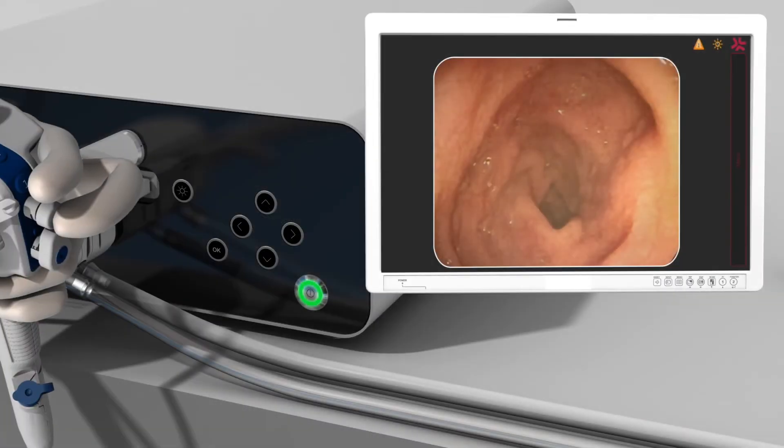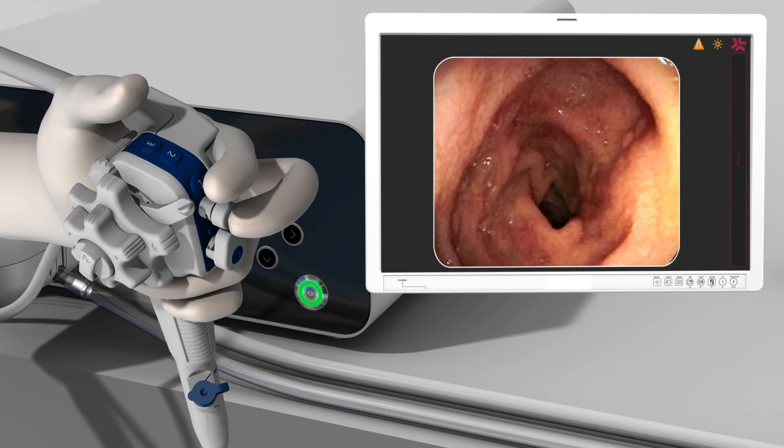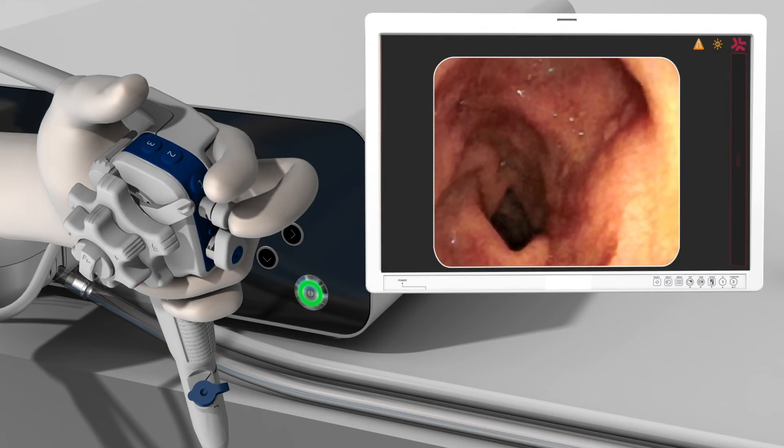The A-Scope Duodino is equipped with three remote switches which can be programmed for various functions through the interface. The A-Box Duodino will capture one image for each press of the switch. It is possible to first freeze the image to ensure it is the correct image for archiving by first pressing switch 1. The live image will continue via a picture-in-picture window. Depressing switch 1 briefly a second time will unfreeze the image.